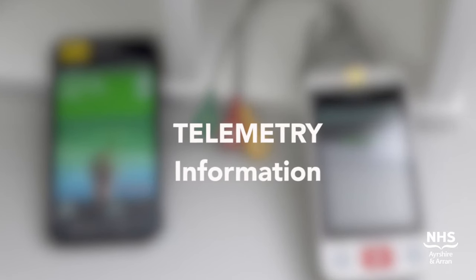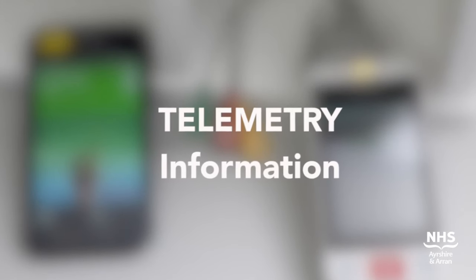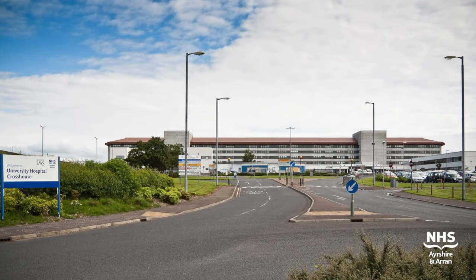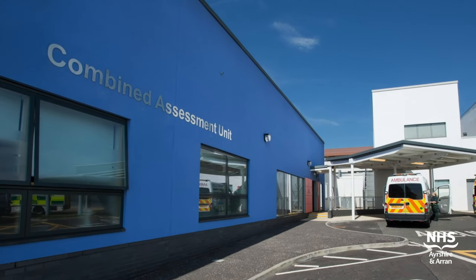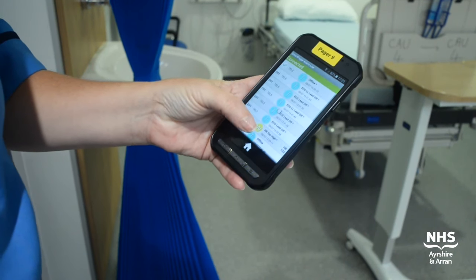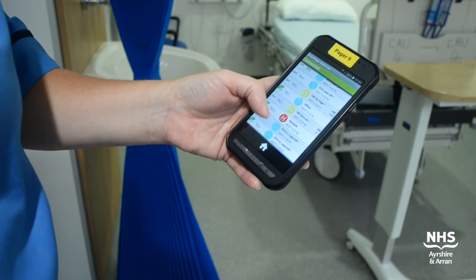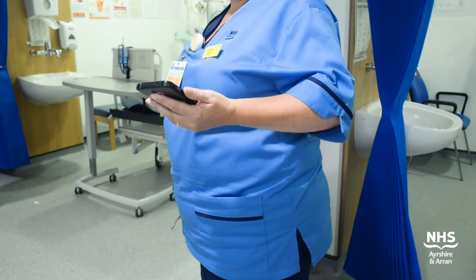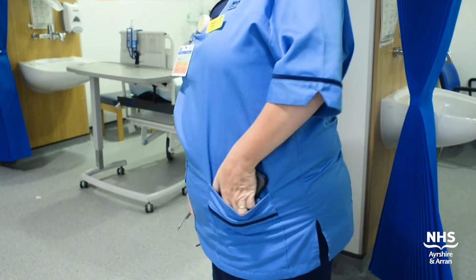This video is to help you familiarise yourself with the CAU telemetry system. The combined assessment unit in Crosshouse Hospital has its own telemetry system. The set up is fairly unique in that each telemetry unit is linked to a portable handset which is carried by a member of nursing staff for continuous monitoring.